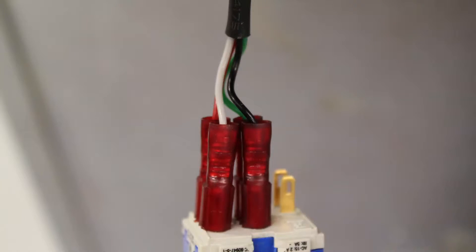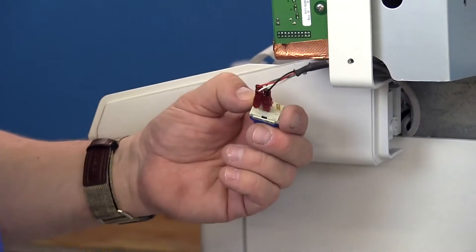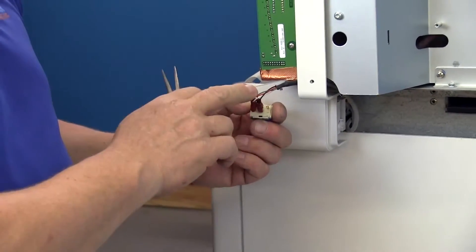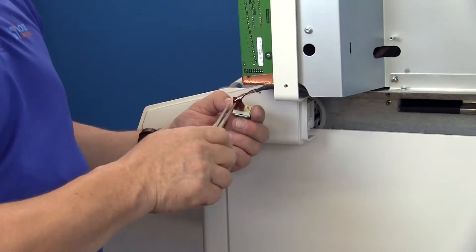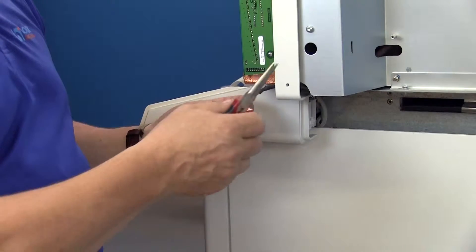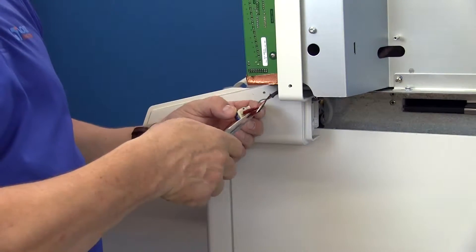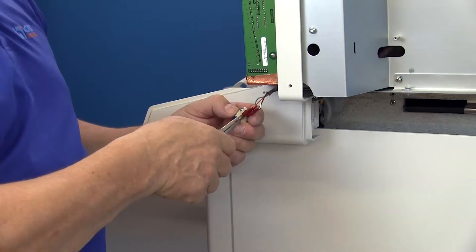On the back side of the switch you're going to have four wires, and you want to make sure that you put them back on the new switch the same way they came off. So either write down a ledger or something so you remember the order: green, red, black, white. These can be really tight so I usually get behind them with needle nose pliers and pull them off the connectors.